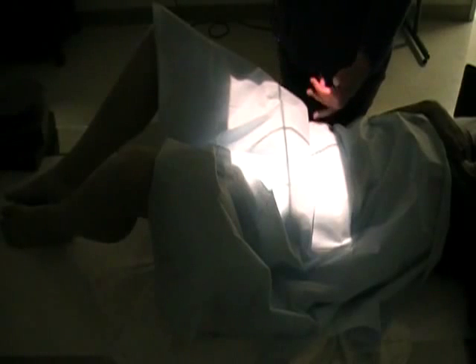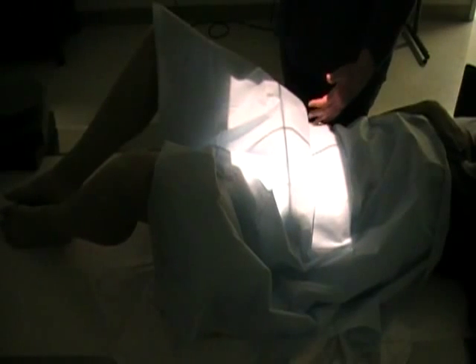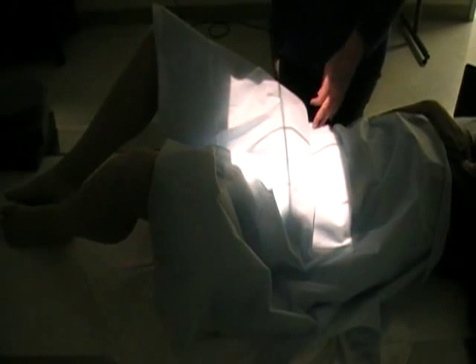Now, on this you can either label it right or left for the pelvis. Just be sure that you use the correct marker. Okay, you can relax your legs. When we're imaging just one individual hip, that's when you want to be sure that you mark that one hip. So if you're doing the left hip, be sure and place your left marker on there.